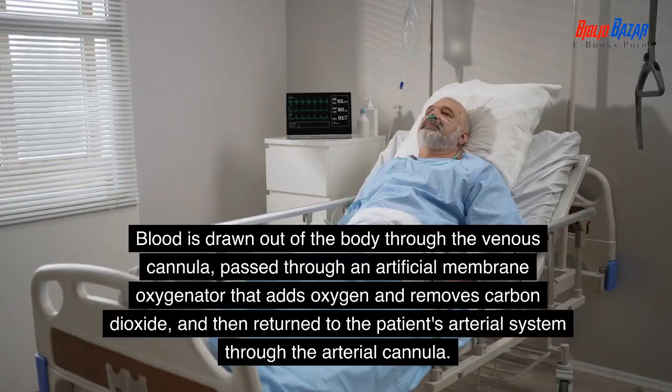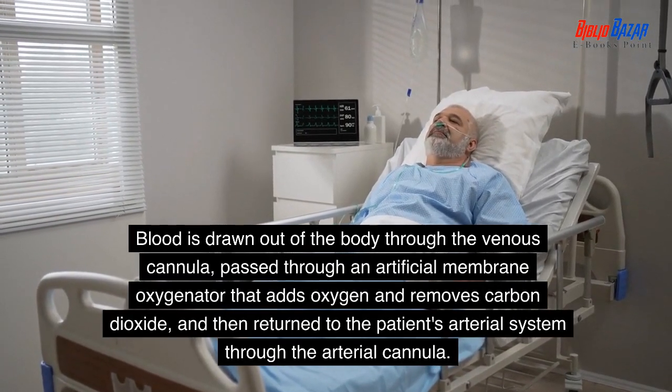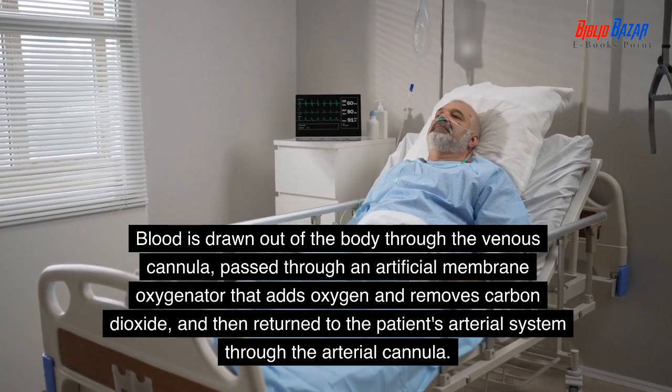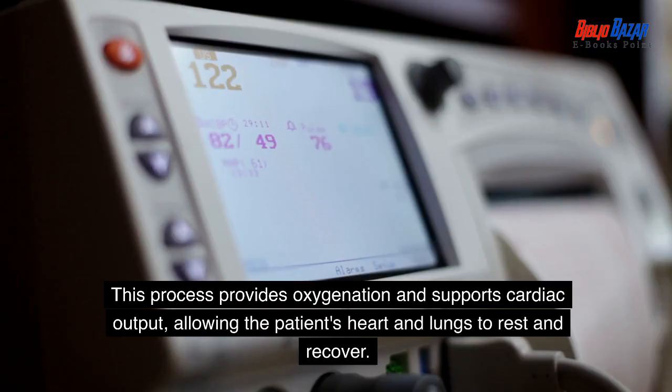ECMO involves the insertion of cannulas into large blood vessels, typically the jugular or femoral vein and artery. Blood is drawn out of the body through the venous cannula, passed through an artificial membrane oxygenator that adds oxygen and removes carbon dioxide, and then returned to the patient's arterial system through the arterial cannula. This process provides oxygenation and supports cardiac output, allowing the patient's heart and lungs to rest and recover.